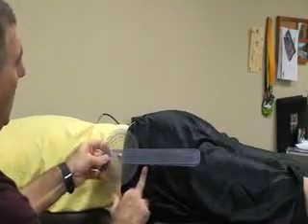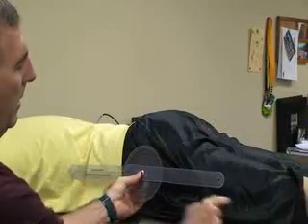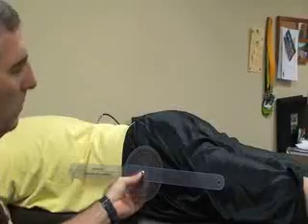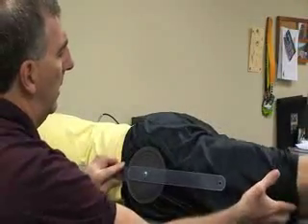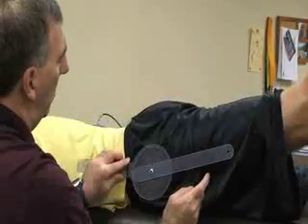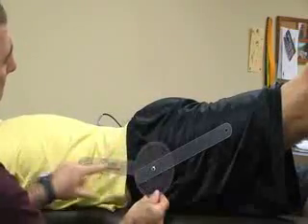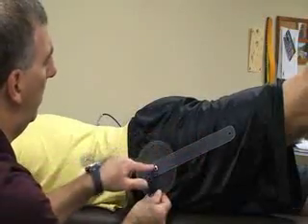My stationary arm is going to be at the midline of the thorax or parallel to it, just like for flexion. And then the moving arm is going to be midline of the femur, just like the hip flexion. Then we're going to have him hyperextend, or we can help him extend the hip backwards, while I'm trying to keep the hip on the table. We would make sure to maintain our landmarks at the thorax, the femur, and the greater trochanter.